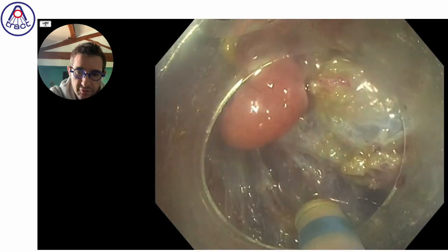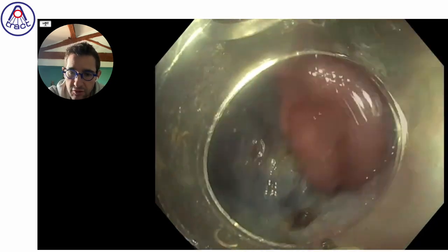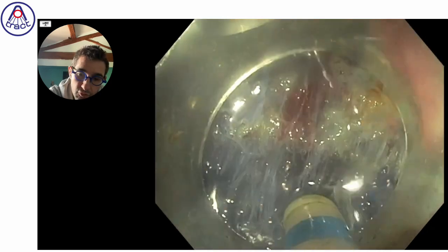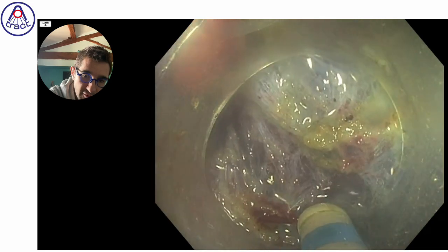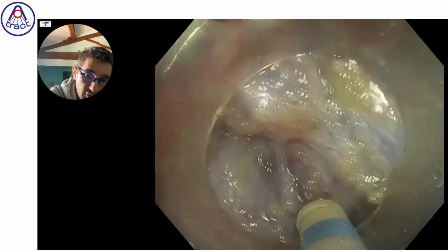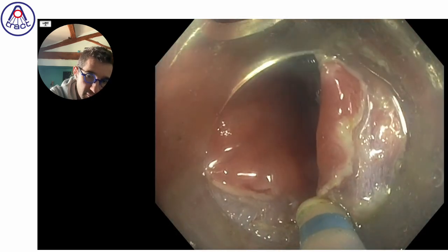I'm not sure that in this case we will have to tighten again the attract because the exposure is still good. The loops of the attract device are very small and therefore we have a strong traction, and sometimes it's not necessary to re-increase traction at the end.